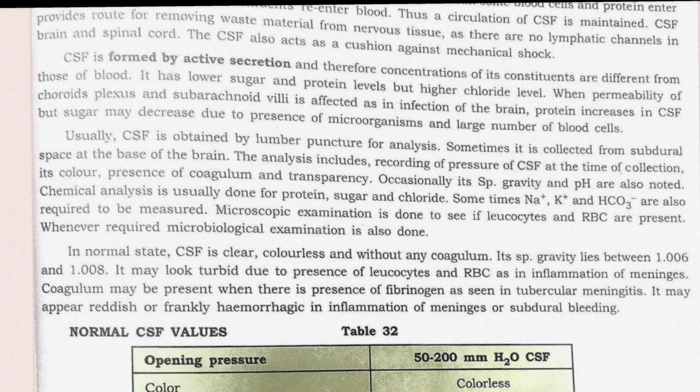The analysis includes recording of pressure of CSF at the time of collection, its color, presence of coagulum and transparency.